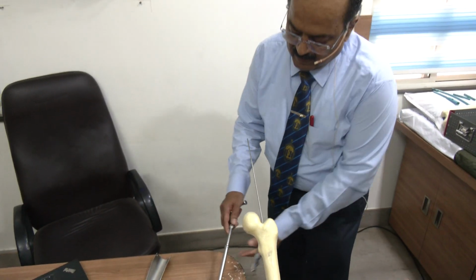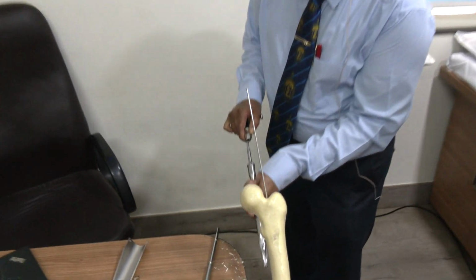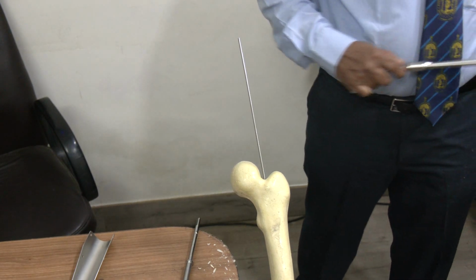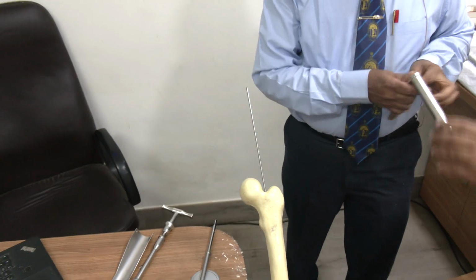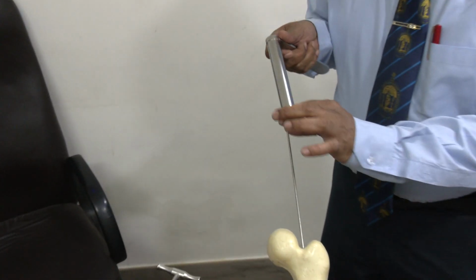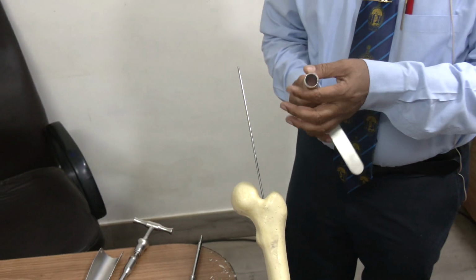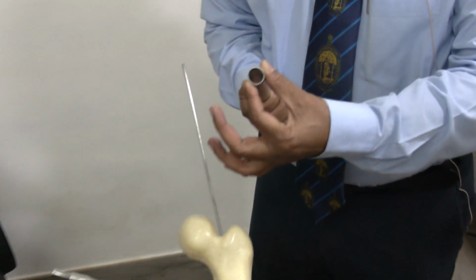T-handle. So, now I am passing the protector sleeve. Over the guide wire, you pass the protector sleeve. So again, this protector sleeve is about 18 millimeter in size.